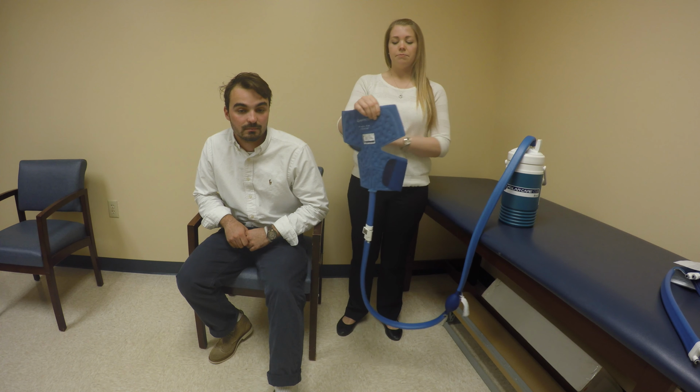When you're ready to fill your wrap with water, you can press down onto the pump until the red ball is in the center of the window. You can press about 10 times until the wrap is filled with water. You can let the wrap then stay with the water in it until it feels it's warming up. Every 3 to 4 minutes you can use the pump to circulate the water so it's always staying as cold as you need it. Feel free to do so as frequently or infrequently as you're needing, depending on how cold the wrap feels.